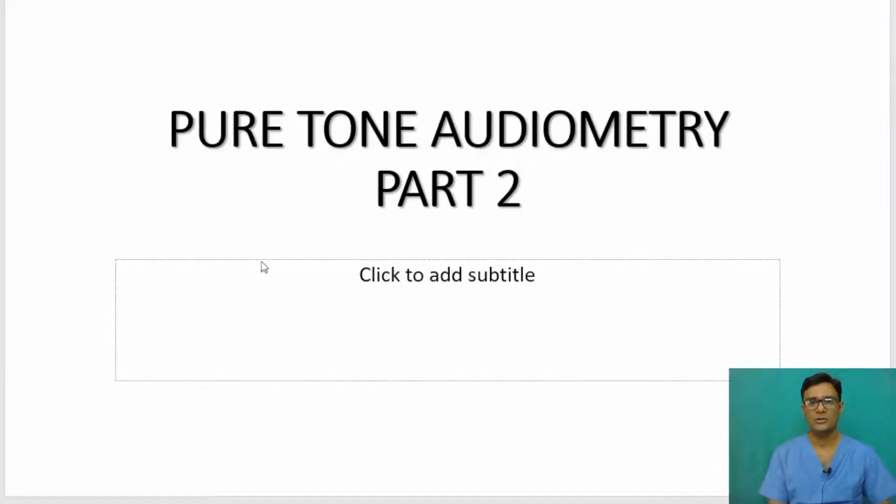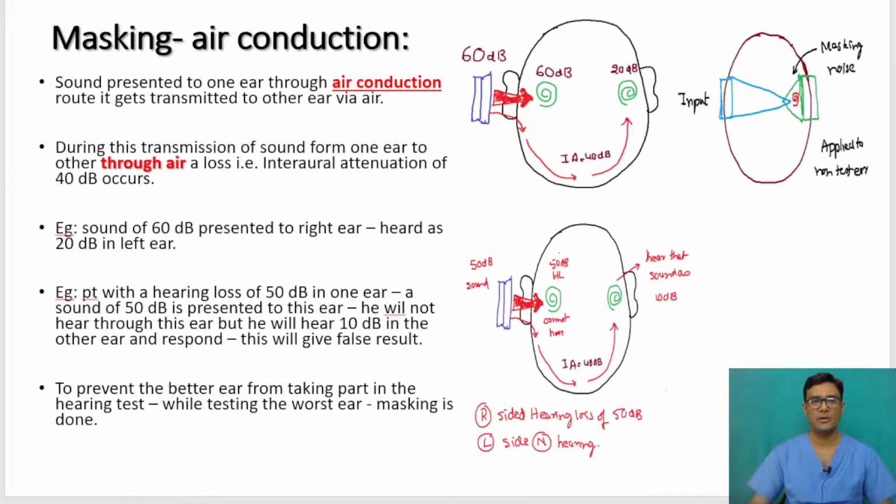Hi everyone. Today let us complete the pure tone audiometry topic. For starting, the first topic here will be masking. Basically, we are talking about masking in terms of air conduction. So, why do we have to do this masking?